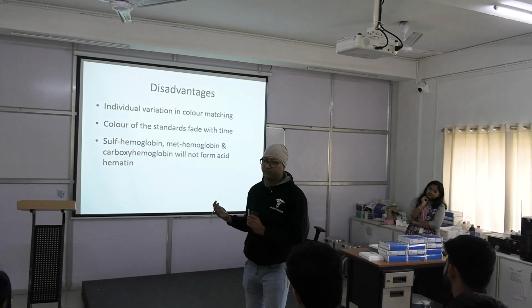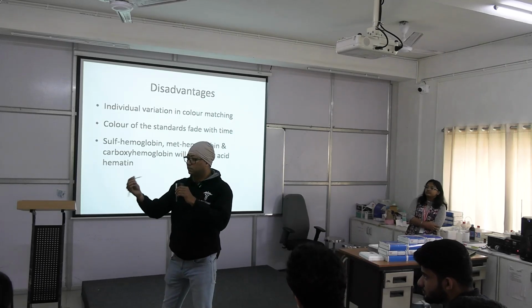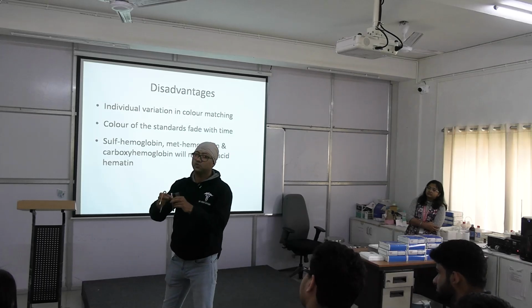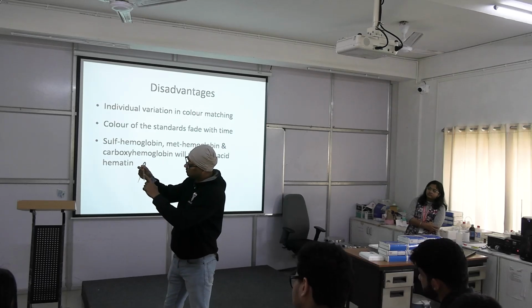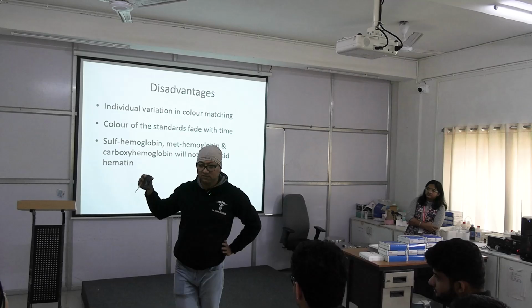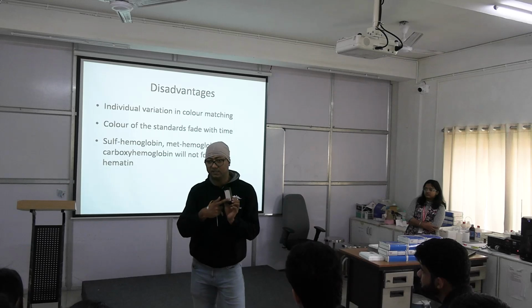Okay, we will use distilled water over here. Okay, till matching. So first take N/10 HCl up to 0.2, take blood up to this point, mix it and इसको आप छोड़ दो for 10 minutes. Okay, उसके बाद add drop by drop HCl until इसका color और ये दोनों side में जो color है इससे match होता है कि नहीं. ठीक है, matching करने के लिए आप पीछे एक plain white paper भी रख सकते हो. ठीक है, यहाँ पर already दिया गया है. ठीक है.